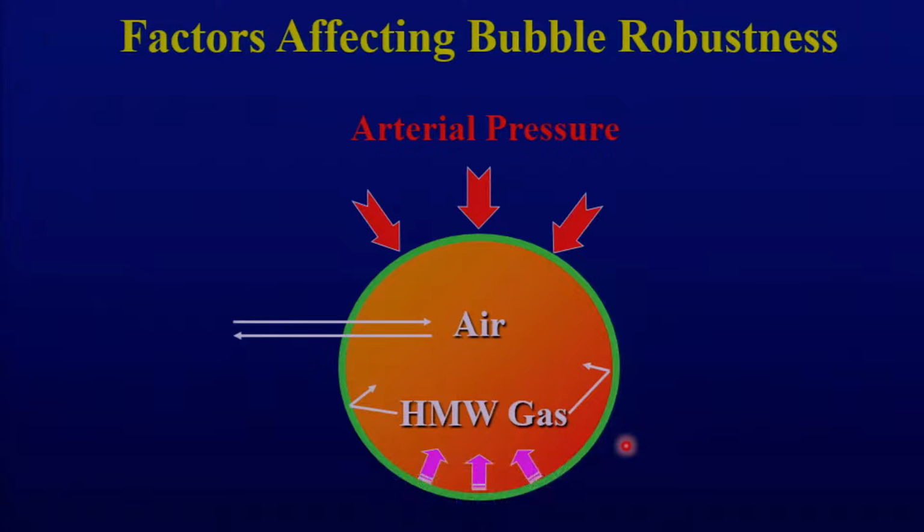And two is, what is this shell that you're talking about here that could be strong enough to withstand pressure from the outside. The early ultrasound enhancing agents were very pressure sensitive. So every systole, contrast almost disappears. It breaks them in every systole. And then in diastole, the ventricle fills. We see much less of that. Nowadays, they are less sensitive to pressure.